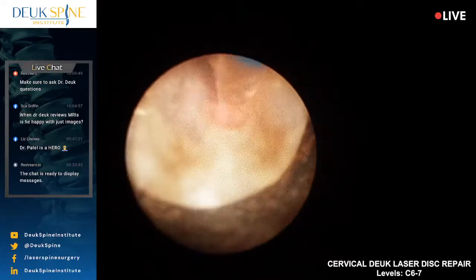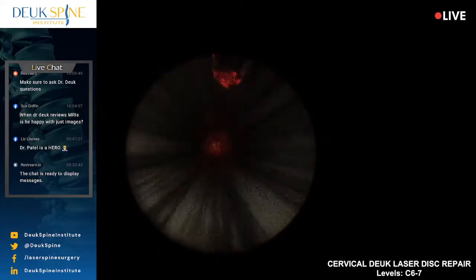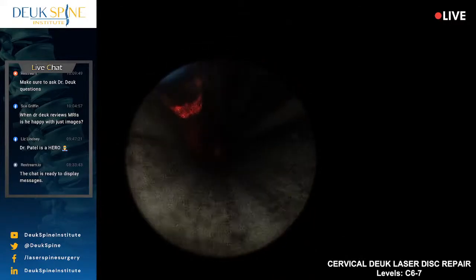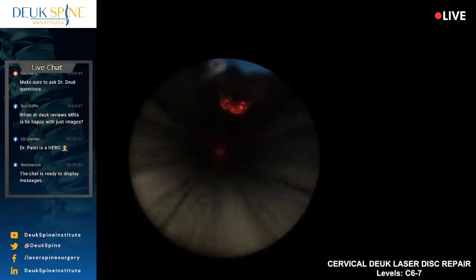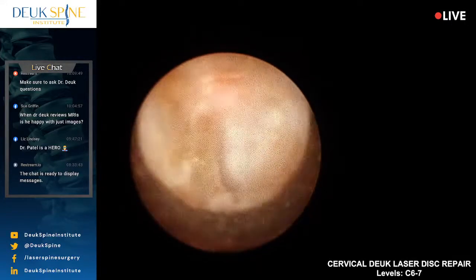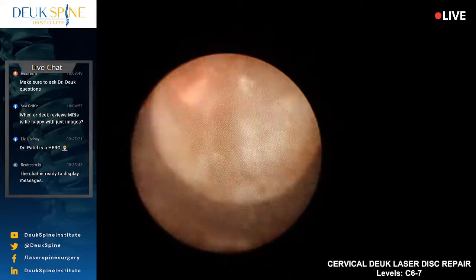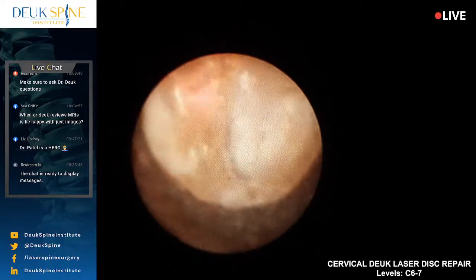The laser really works by delivering energy directly to tissues. I'm going to flip it around. And just to be able to mobilize things, you've really got to go back and forth. So you're going to see me flipping the laser around and using it back and forth. Meanwhile, I'm putting some pressure on the tube.